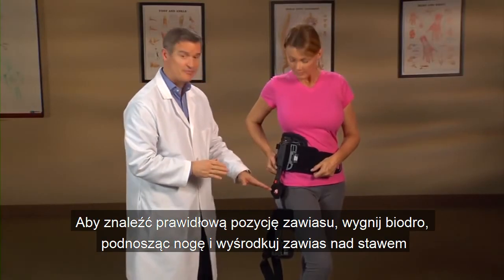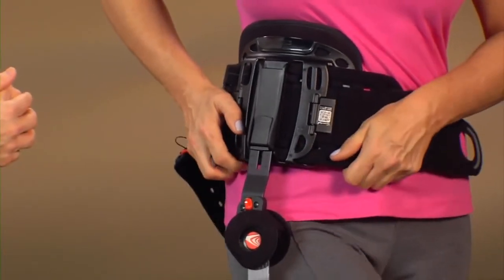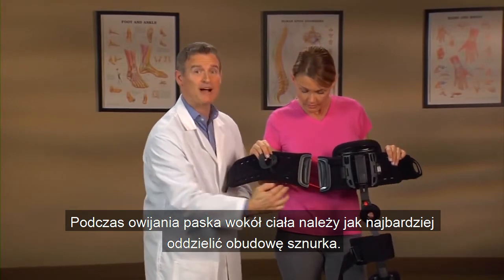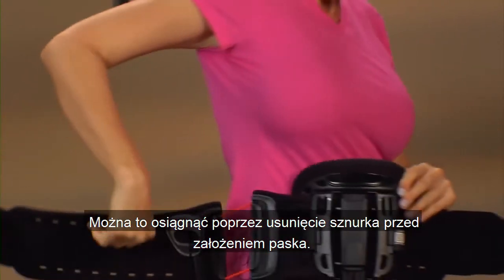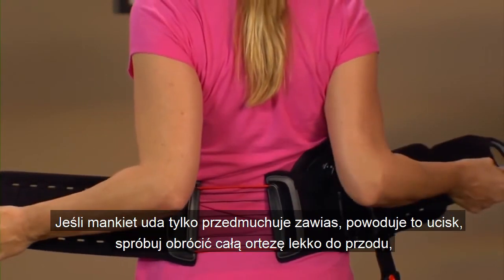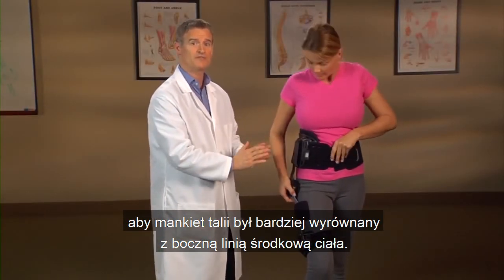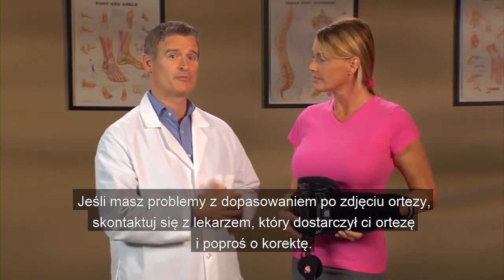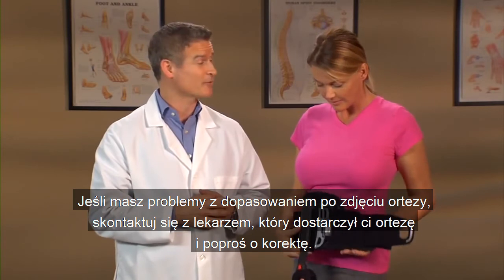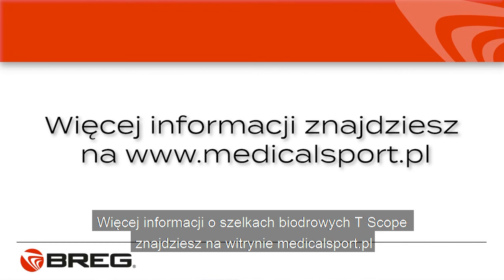To find the correct position for the hinge, flex your hip by raising the leg and center the hinge over the joint where the leg and hip pivot. Make sure to separate the lacer housing as much as possible when wrapping the belt around the body to ensure enough compression when the lacer pull is engaged. This can be achieved by removing the lacer pull before applying the belt. If the thigh cuff just below the hinge is causing any pressure, try to rotate the entire brace slightly forward so the waist cuff is more aligned with the lateral midline of the body. If you have fitting problems after you remove the brace, contact the healthcare professional who provided you with the brace and request an adjustment. If you have general questions about your T-Scope hip brace, call Breg Customer Care at 800-897-2734. You'll find more information about T-Scope hip braces at Breg.com.